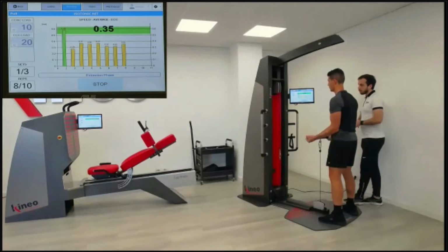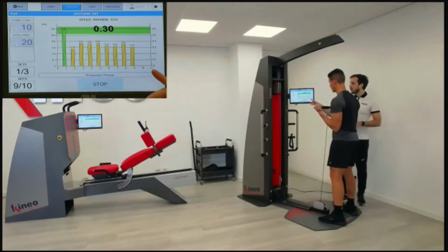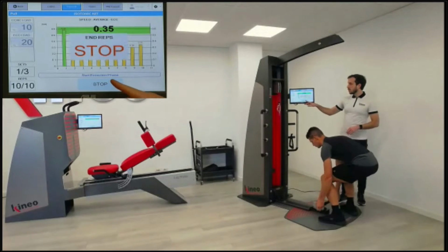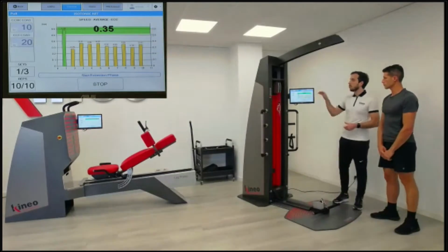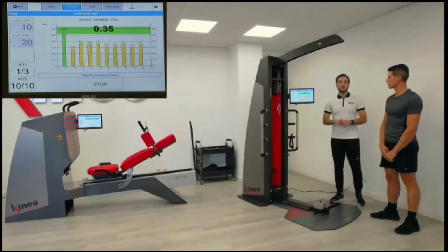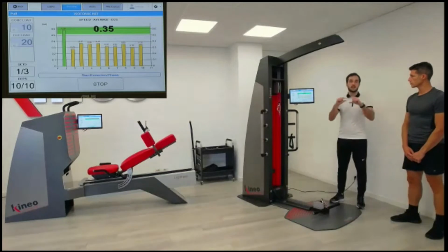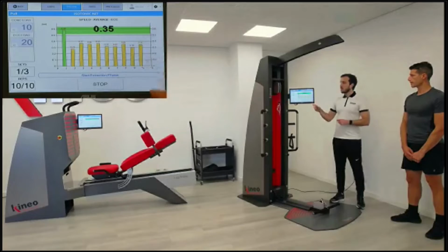So now, let's make also one quick example. Now, there is a trend. So please stop, thank you. We can see a trend here. So we see that Damiano was training almost at 0.32 meter per second. But as you can see, the biofeedback set his target line, the green line, the execution line, too high. It was the first repetition.